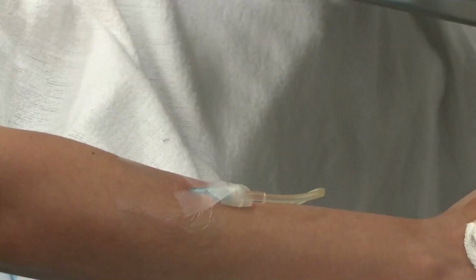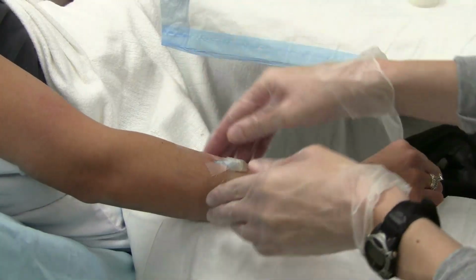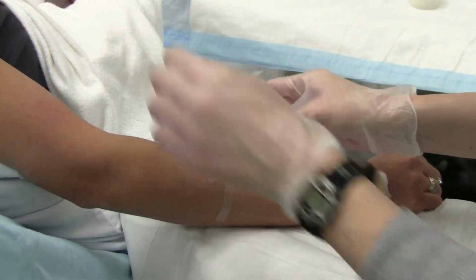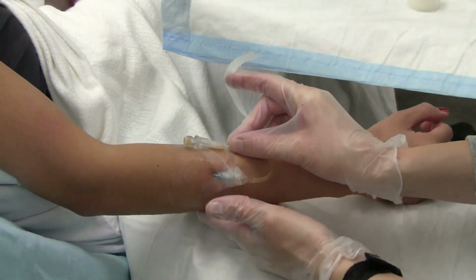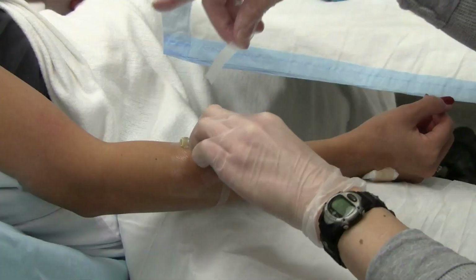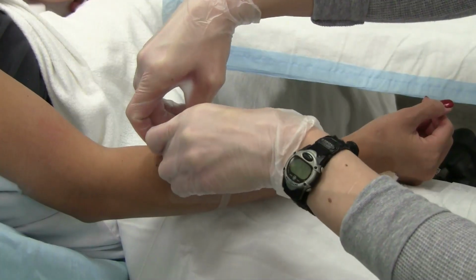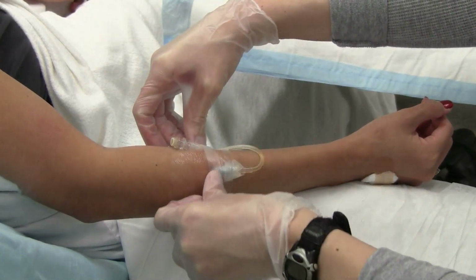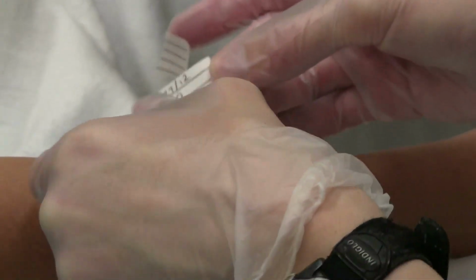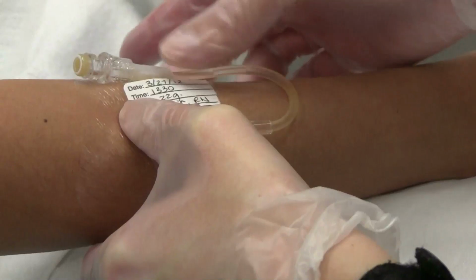To secure the saline lock, you may use a chevron style of taping or loop the tubing with tape. Label your venipuncture site with the date, time of insertion, type and gauge of catheter used, and the nurse's initials. Discard tourniquet, remove gloves, and discard gloves. Perform hand hygiene.